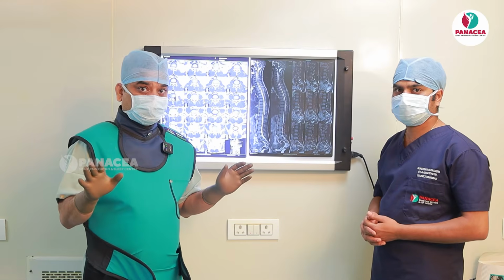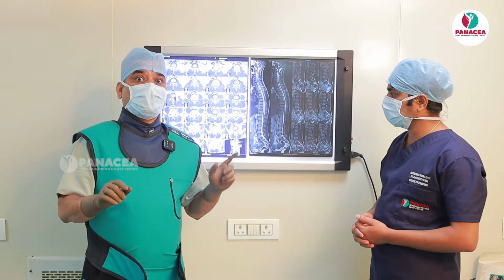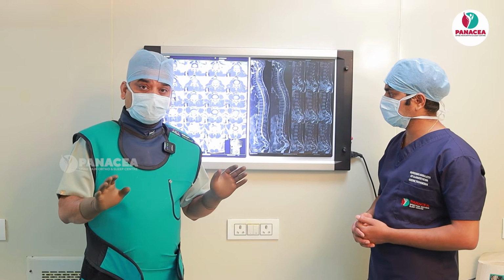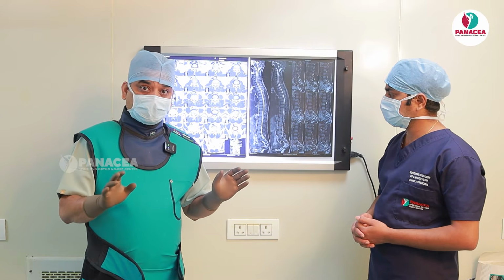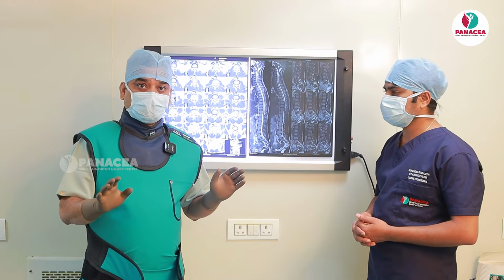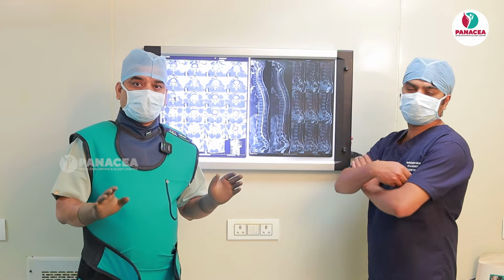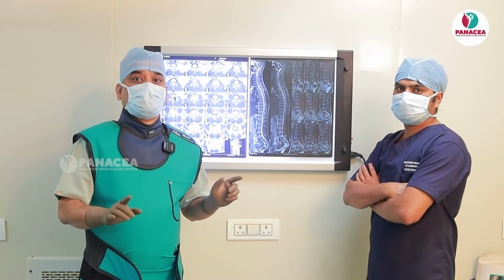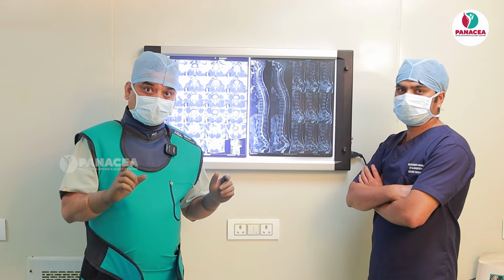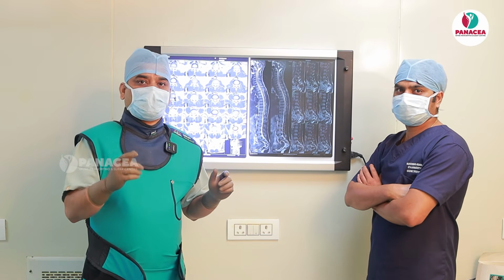This is a case of L4-5 disc herniation radiating to the left lower limb. The patient already had conservative management in the form of physical therapy, NSAIDs, muscle relaxants, but he is not relieved of the pain. Now he has opted for epidural injection. We are going to do a transforaminal epidural injection. That's an infraneural technique, or otherwise called Kambin's technique or suprapedicular approach.